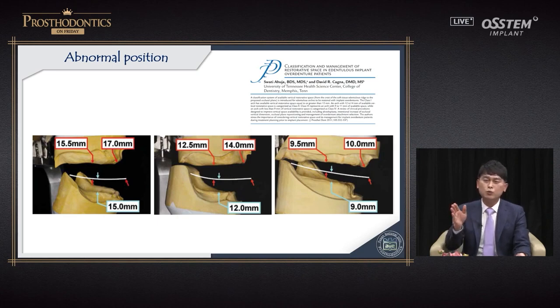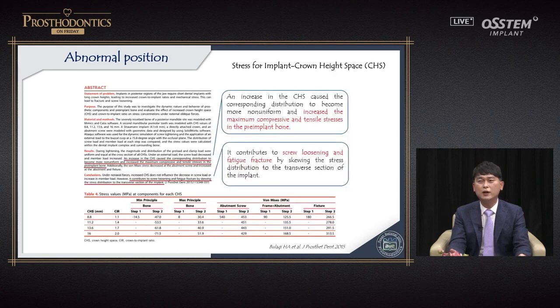However, horizontally there's a big deficiency. So when horizontal bone resorption is there, using a fixed prosthesis will result in protruded teeth. Is that the right approach? We thought about something new, especially when it is over 12 millimeters, the crown length. The crown ratio is very unfavorable.